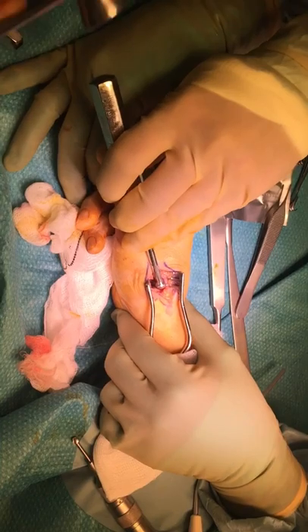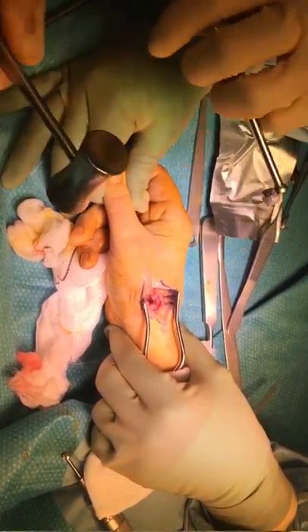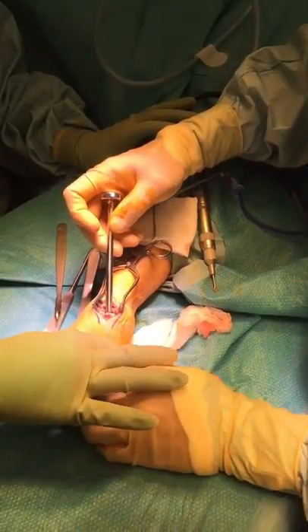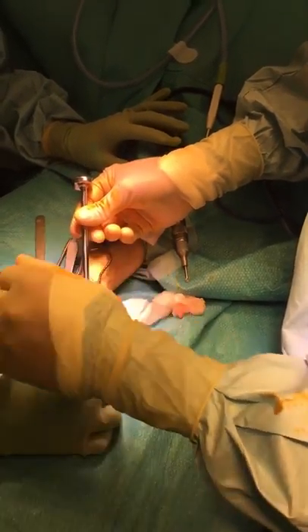The definitive trapezial component is then inserted. Next, the metacarpal stem is inserted. The trial head is applied, and once seated, the definitive head is applied.